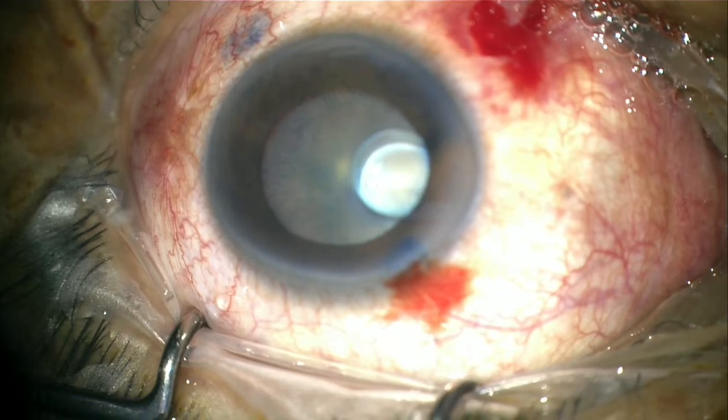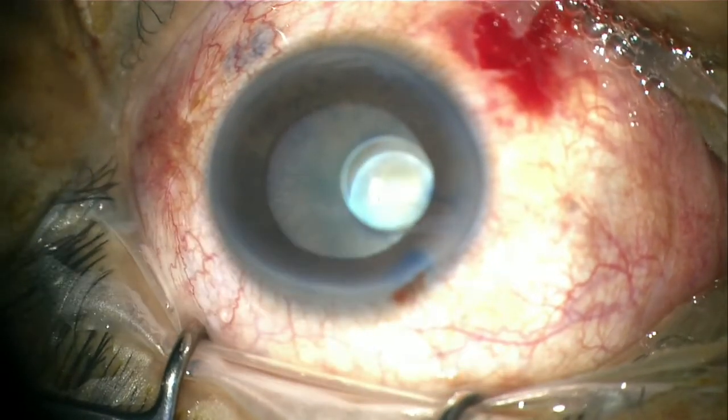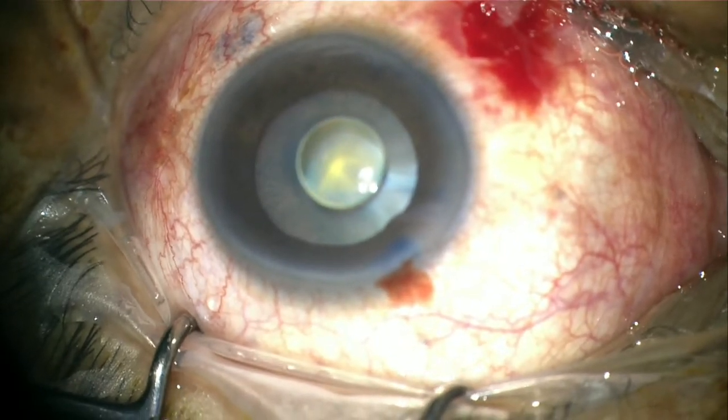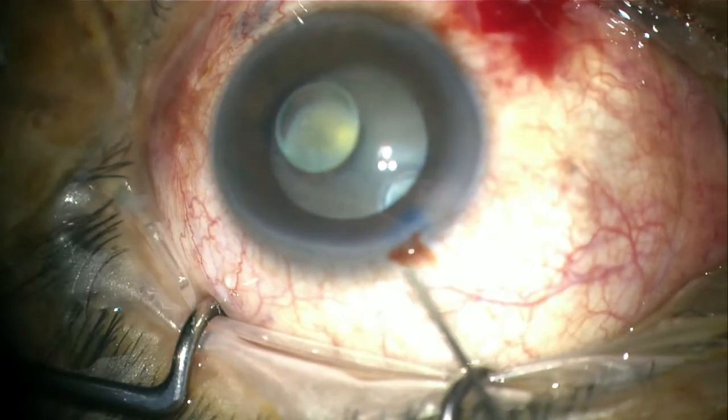As the surgeon completed capsular staining, some amount of heavy oil migrated from the posterior segment. Slowly, more and more oil migrated to the anterior chamber. In order to proceed with the cataract surgery safely, the heavy oil has to be removed safely.